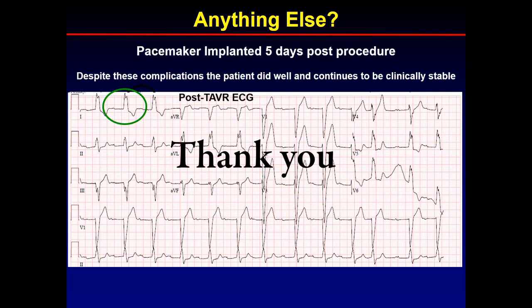I think that's well said. I have one comment on the case that you showed. I thought I saw something we see with infolding in self-expanding valves, a phenomenon you have to be aware of, especially in a very calcified valve. You may see some infolding and a string sign, and I thought I saw it on the side. If that's the case and you do post-balloon and it doesn't help, you probably have to put another valve in a valve to overcome this. Yeah, and that's exactly what happened, because balloon expansion didn't do anything, and that's why a second valve was deployed.